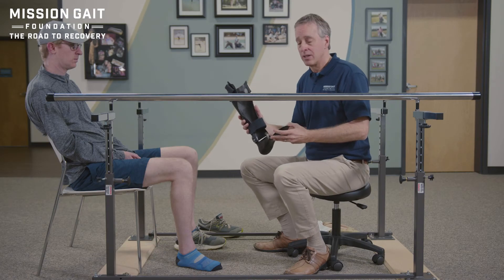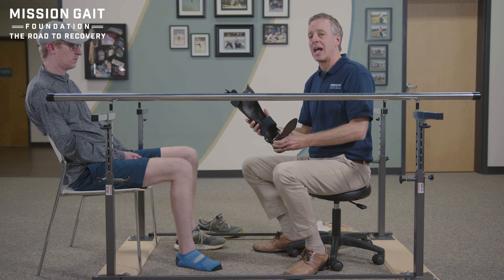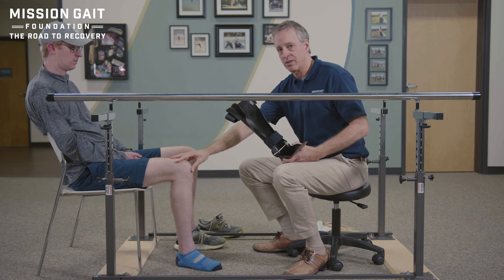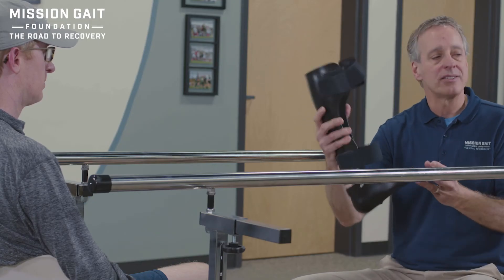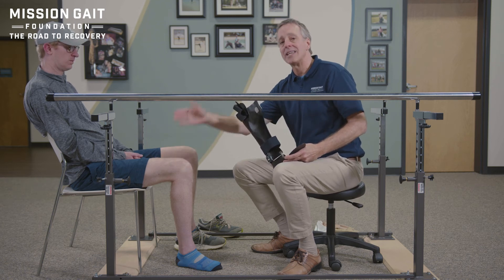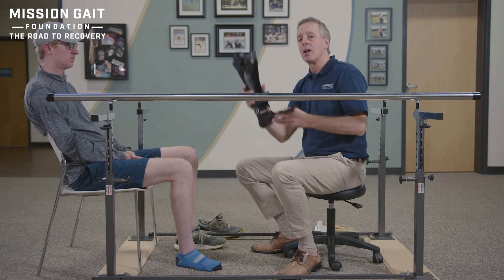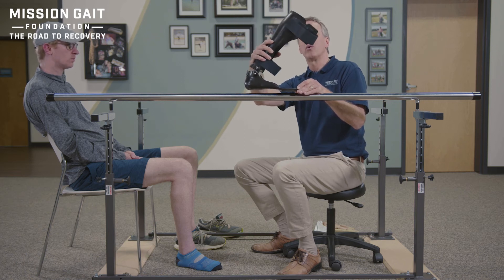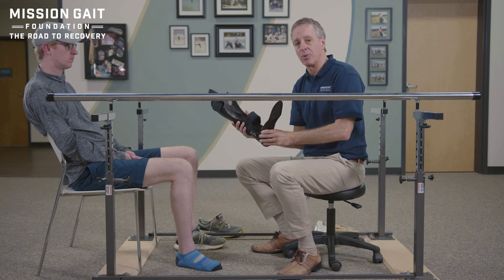In this particular case, we're dealing with an articulated AFO and a patient that has a history of a central nervous system injury, so we have tone concerns on the right side of the body. Why a plastic articulated brace? Because with tone in this leg, as he is in stance phase, the leg is going to want to pop back into hyperextension. This brace allows us to come over the top and keep the tibia moving forward and not forced into hyperextension - that's why we use an articulated brace in this case.